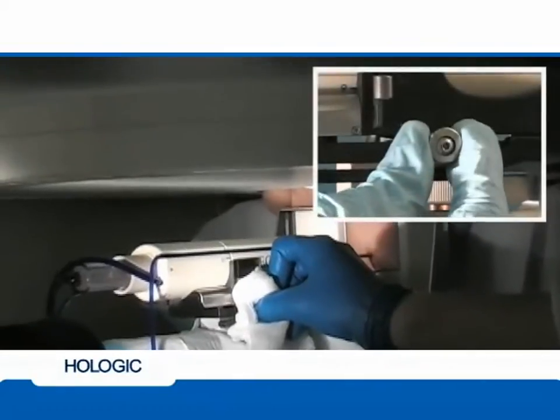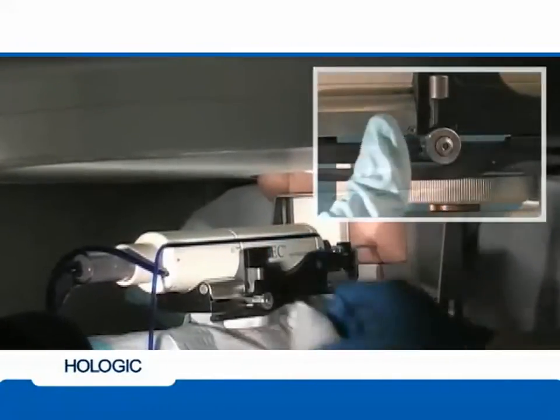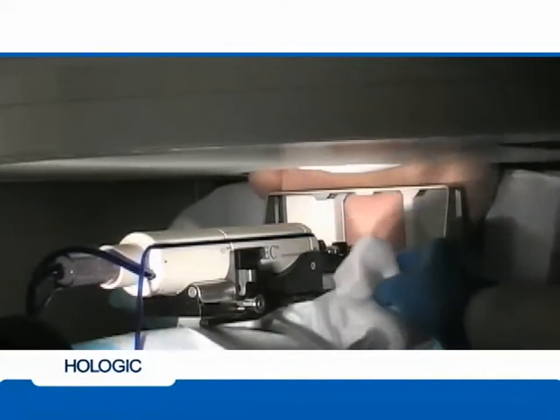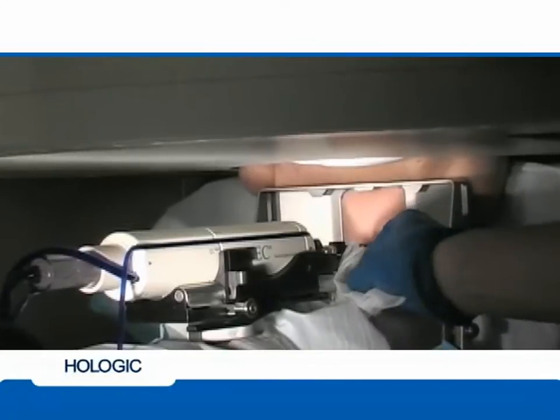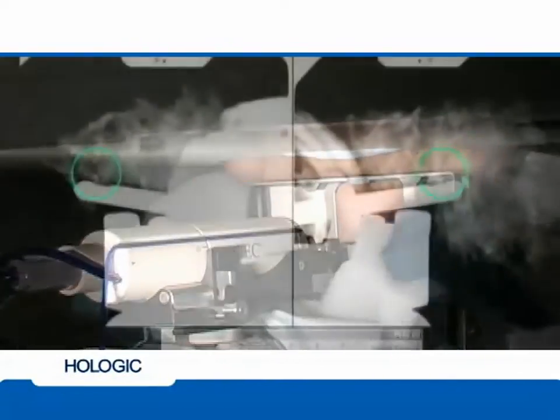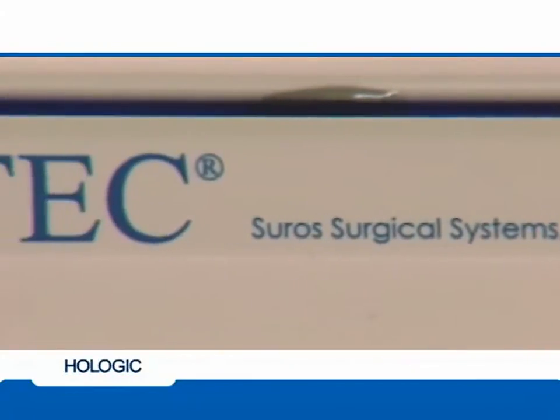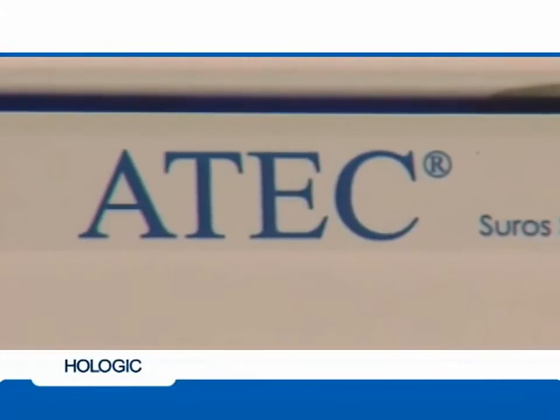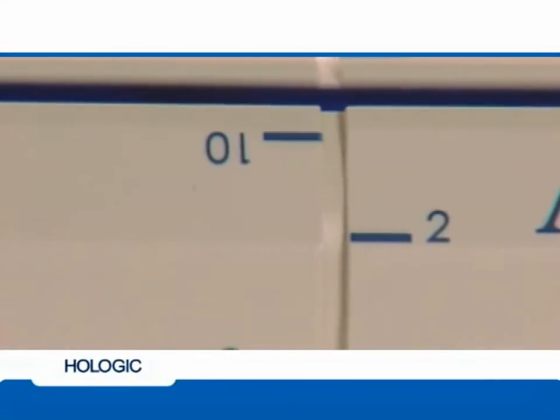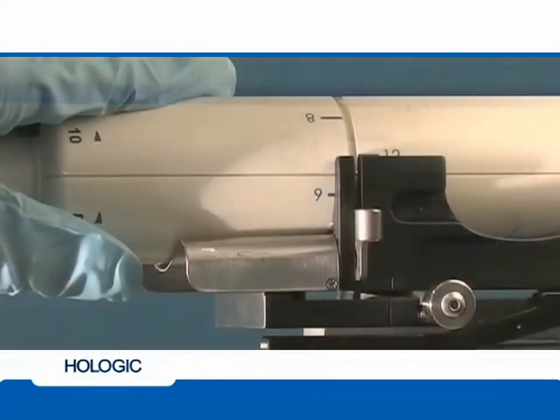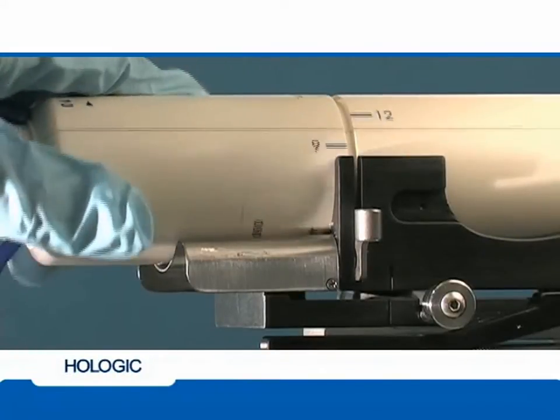The ATEC adapter is then fired by pulling the release bar out and down to advance the adapter 20 millimeters forward. The technologist takes a pair of post-fire images to ensure the center of the aperture is at the area of interest. Cores can be taken at any clock position at the discretion of the physician and depending on the location of the area of interest.